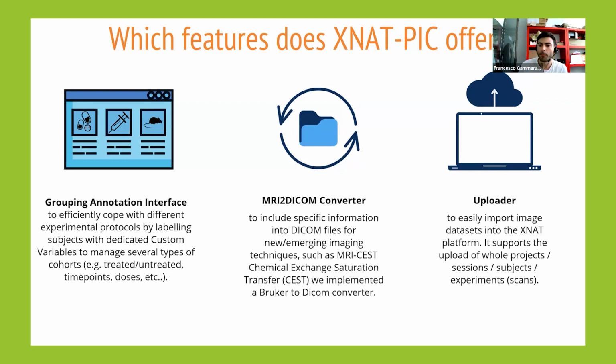And then XNAT-PIC allows you to import image datasets into the XNAT platform in a very easy way. And the uploader supports the entire project, sessions, subject, experiment.